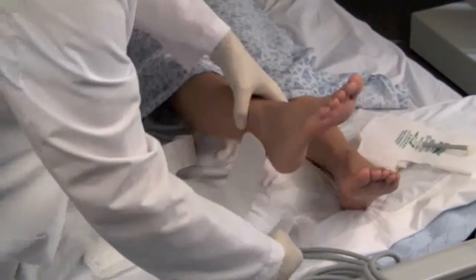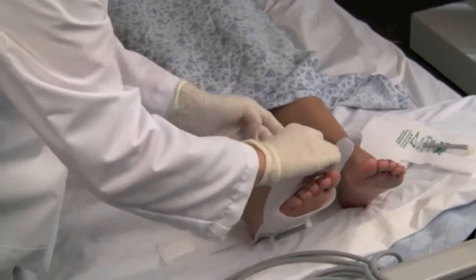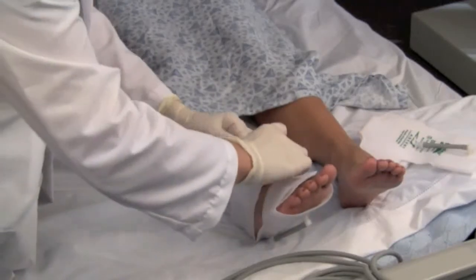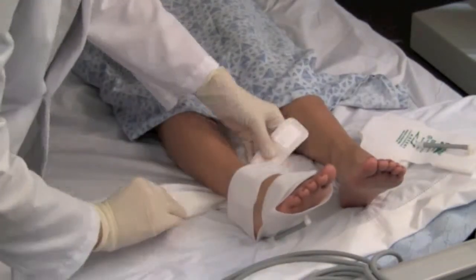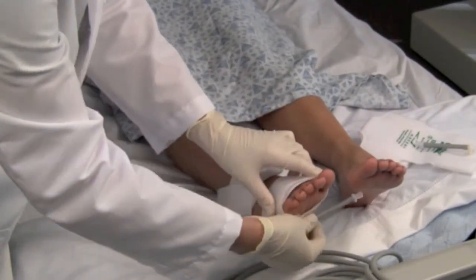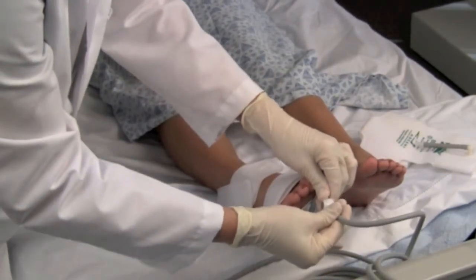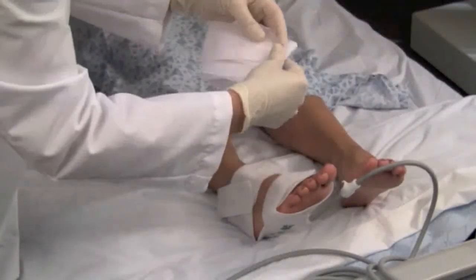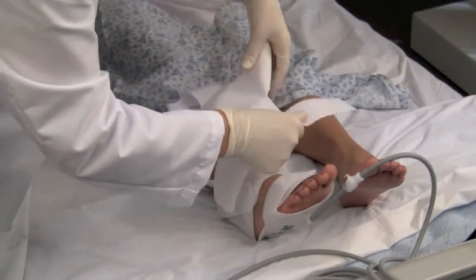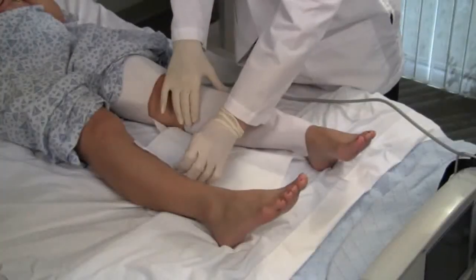Foot garments may be used on either foot and should be removed regularly to inspect the skin. Unfold the garment and position the inflatable center bladder directly below the arch of the patient's foot. Snugly wrap the garment around the patient's foot and secure the hook tabs. Wrap the ankle straps around the back of the ankle and top of the foot. Attach the garment to the tube set by pushing in the silver latch on the female tube connector and inserting the male garment connector firmly into the tube connector until a click is heard. Foot garment should be removed prior to patient ambulation or transportation.